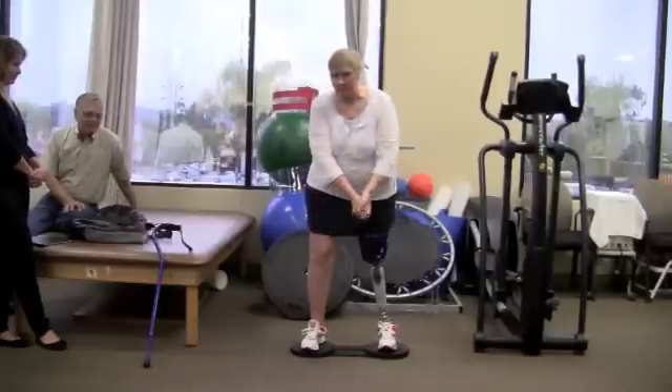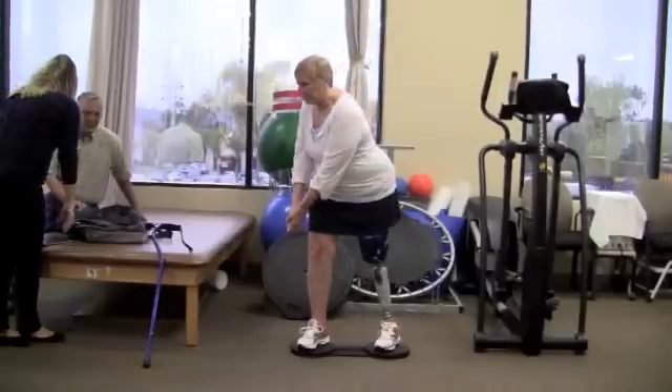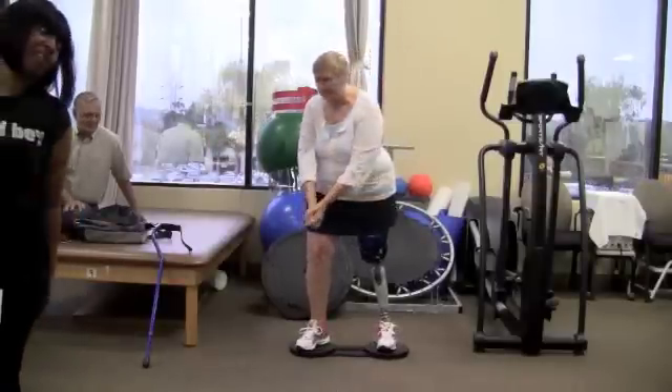After two more times, we discussed the advantage it would be for me to use this on a regular basis, as my body, like many others, tends to stiffen up. I now have the 8-board at home to use on a daily basis.